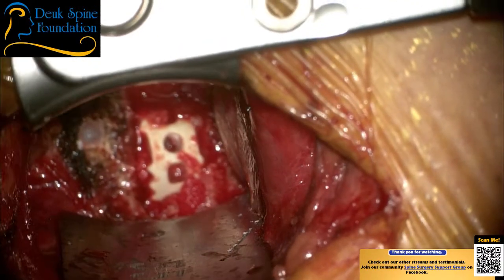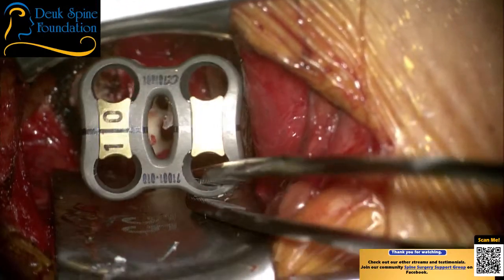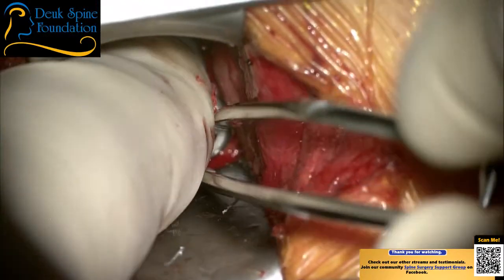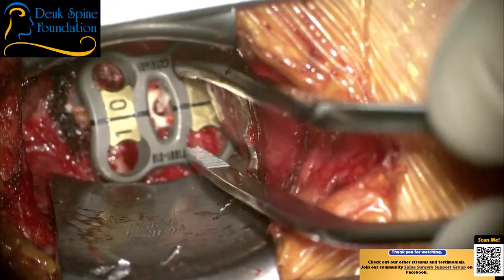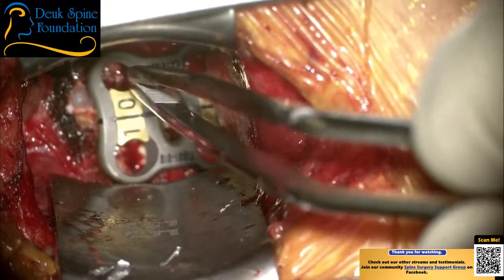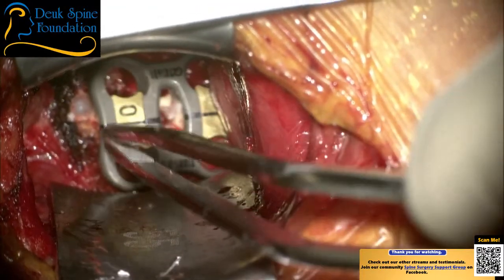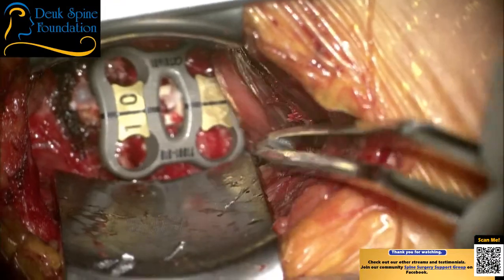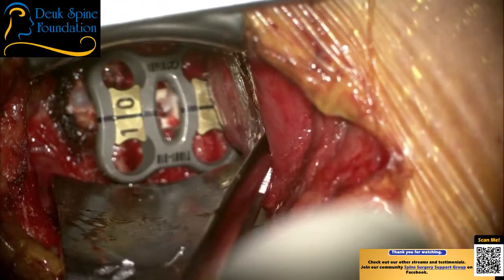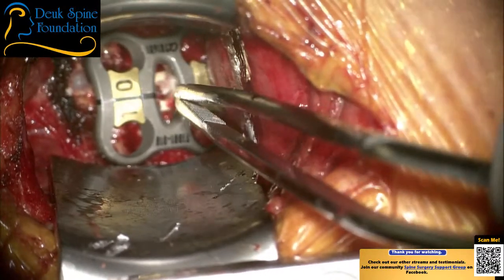I have a special plate I use because the ones they sell normally are too big, too long. So I have a 10 millimeter they've made for me, which is perfect. Look at that. In my opinion, everyone does this differently. What you don't want is the top of the metal way up here pushing on the next disc, or the bottom of the metal down there pushing on the next disc. So you really want the plate to fit perfectly and properly.